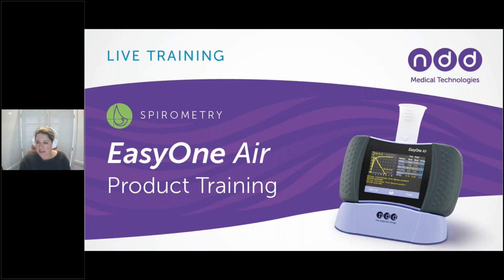All right, so in this training, we are going to talk about the basics of spirometry, starting from how to enter the patient data into the spirometer, how to successfully coach a patient through a spirometry maneuver. We're going to focus on just the FVC, the expiration only maneuver today. We're going to talk about how to interpret the quality messages that are coming from our spirometers to us. A little bit of tips and tricks on reporting some results, and then we will end the last 10 minutes or so of the presentation with a live Q&A session.